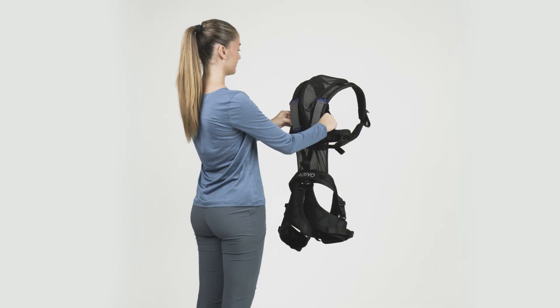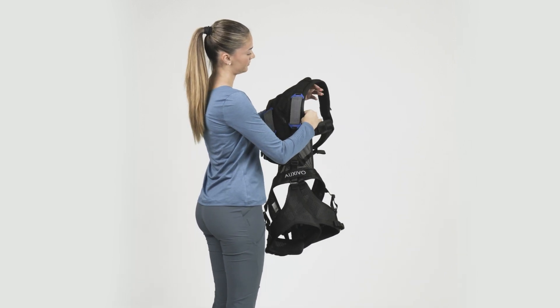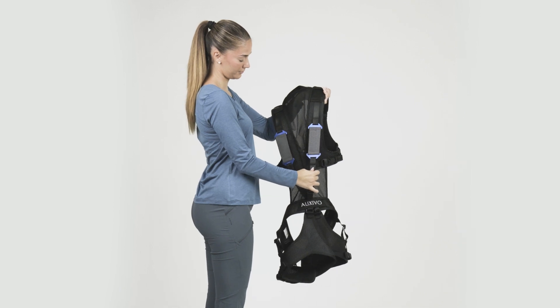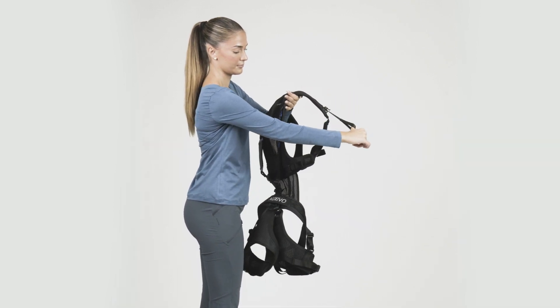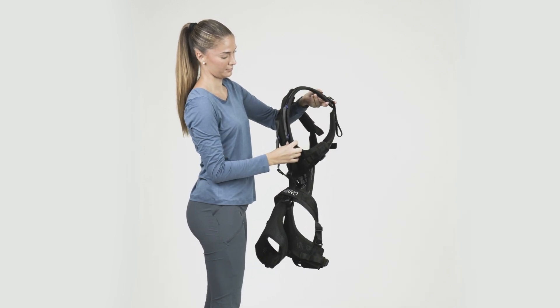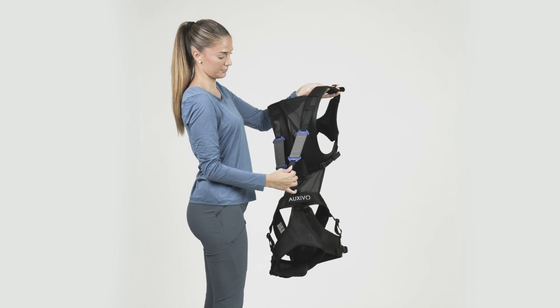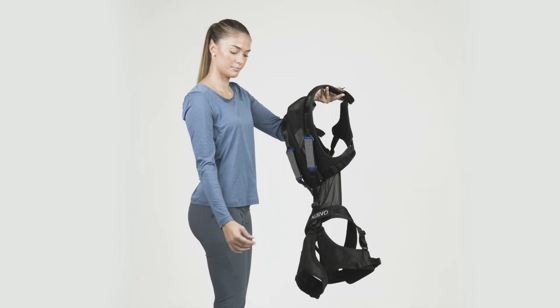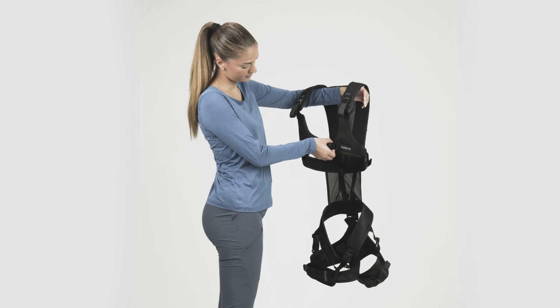Before you put it on, familiarize yourself with the features of the Exoskeleton. Identify and stretch the elastic bands on the back. Test the back support activation using the looped straps at the front of the vest. Try deactivating it again by lifting the buckles and pulling the band backward. And lastly, identify the straps and buckles for size adjustment.